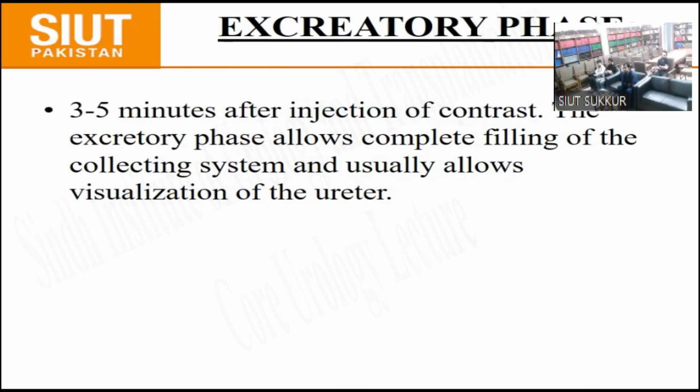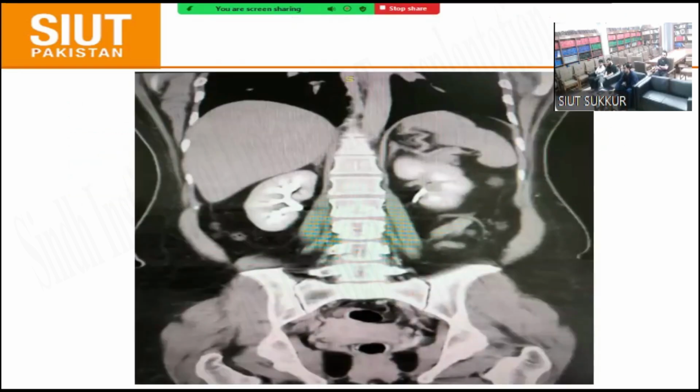So the excretory phase, in which images are taken between 3 to 5 minutes after injection of contrast, allows complete filling of the collecting system and usually allows visualization of the ureter.